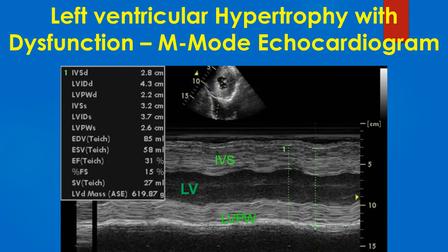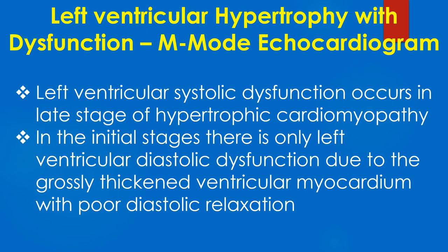Another case showing left ventricular hypertrophy with dysfunction on M-Mode echocardiogram — gross left ventricular hypertrophy and moderate to severe left ventricular systolic dysfunction. The inset shows a short axis view of the left ventricle demonstrating severe concentric LVH.